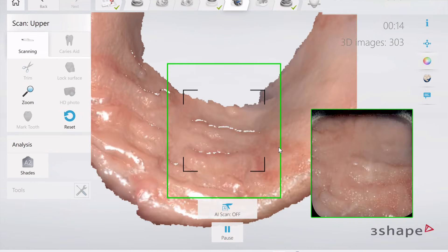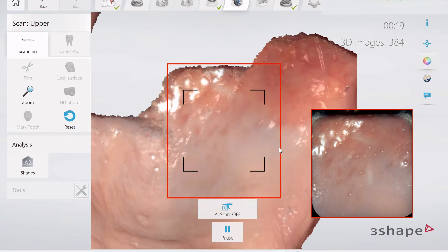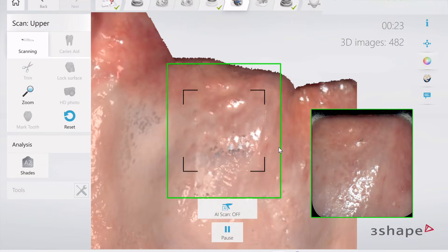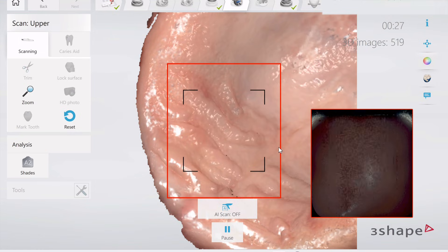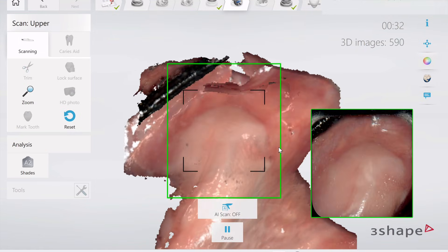That includes the crest of the ridge and the palate, starting in the rugae and then going into the hard palatal wall and then to the vibrating line back there with the start of the soft palate. What's cool about color scanning is you can see the change in color, you can see the capillaries, the blood supply, you can see minor salivary glands.